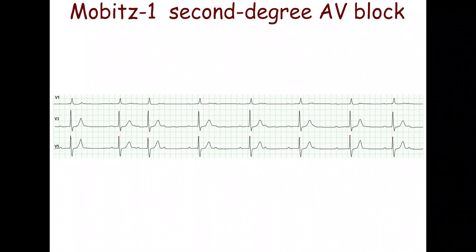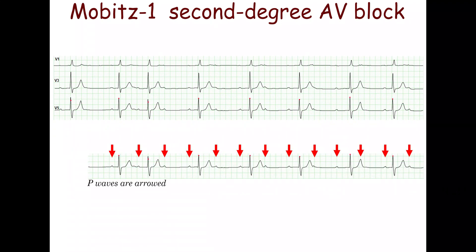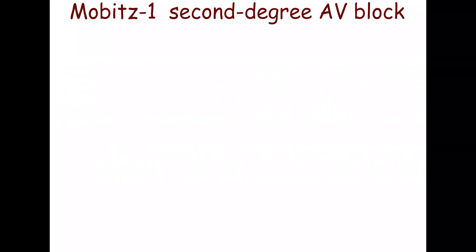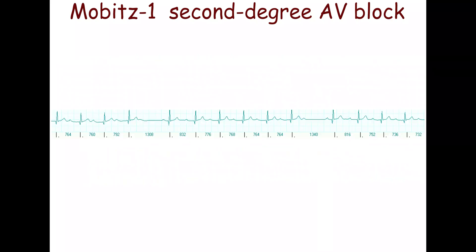Occasionally, atrioventricular block with a 2 to 1 conduction ratio is seen, accompanied by the occasional conduction of 2 consecutive P waves. If PR interval prolongation is observed, Mobitz 1 is the cause of the 2 to 1 conduction ratio. If the cycles are short enough, it is easy to see that the RR interval becomes progressively shorter with each beat. However, the last RR interval in the cycle following a non-conducted P wave may be slightly longer.